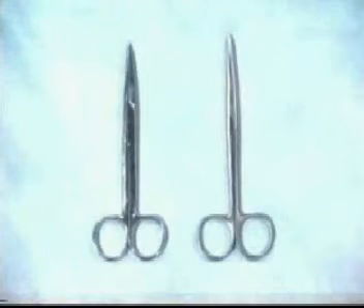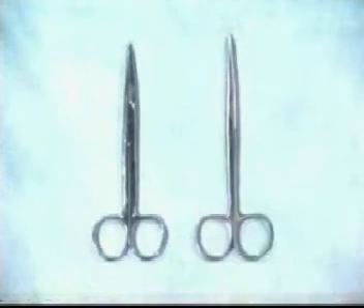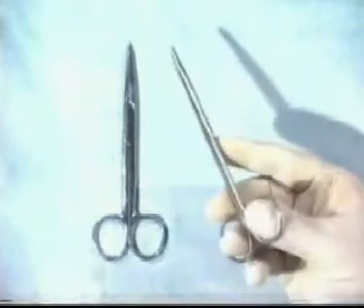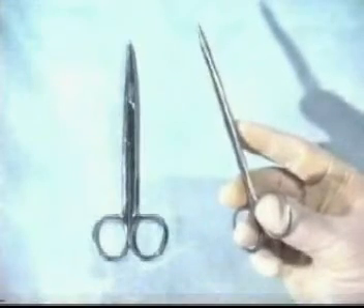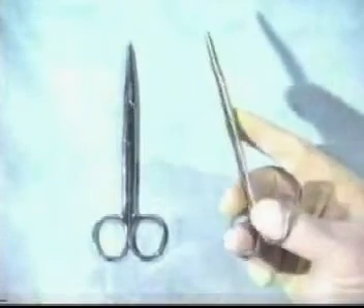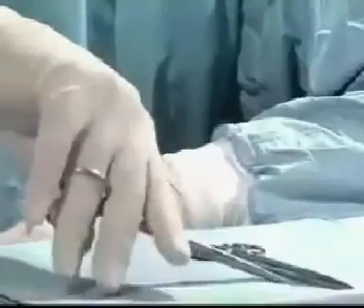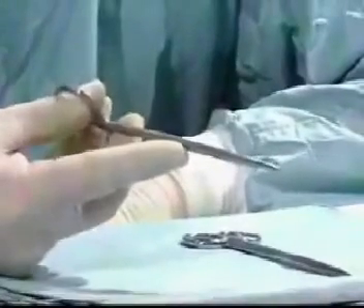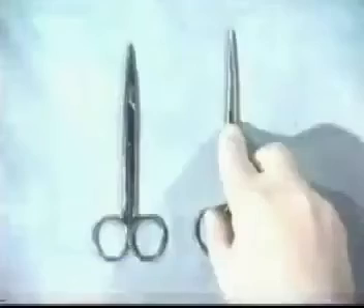There are two types of scissors: one is more robust for cutting suture materials, and the other is finer for tissue dissection. Hold scissors with just the tips of the distal phalanges, with thumb and ring finger in the rings, steadying the scissors with the index finger and middle finger. Never put your fingers right the way through, as this makes it difficult to extract your fingers from the instrument. Using just the distal phalanges gives very good control for accurate dissection.